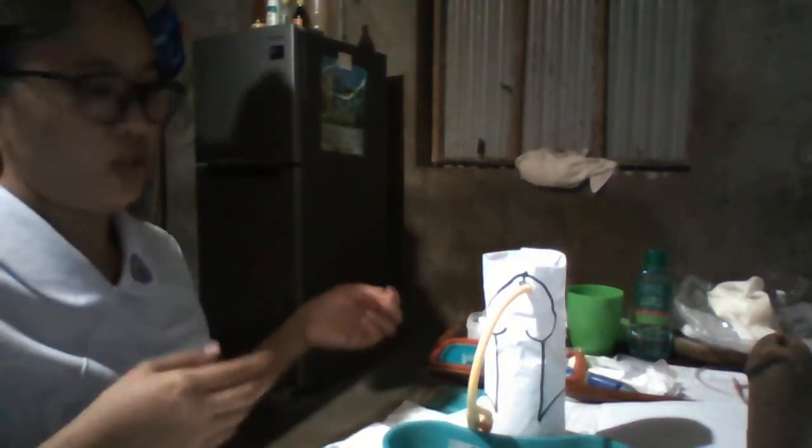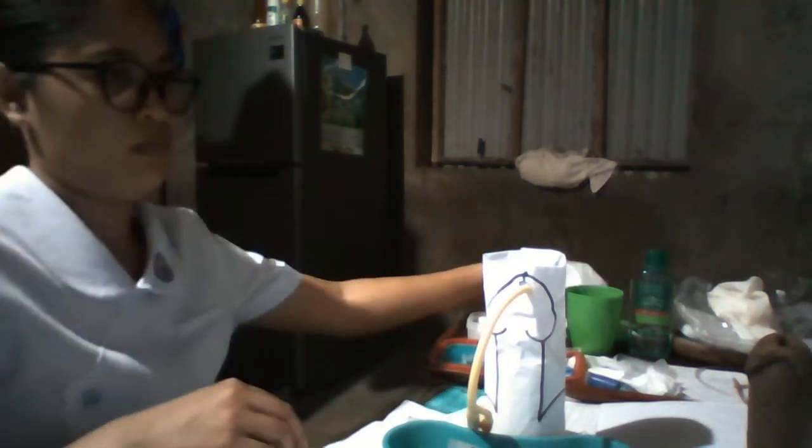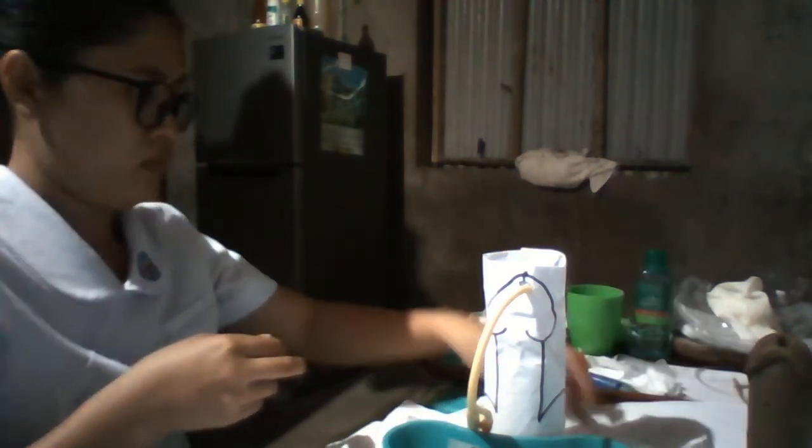Afterwards, we're going to assist the client to a comfortable position. We're going to drape.